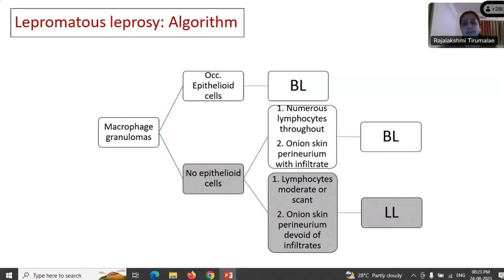And it is not necessary that patients will always come with the typical history of lepromatous leprosy. In fact, we have seen patients coming with type 2 reaction de novo, without a previous history or anything suggestive of leprosy. So I think our index of suspicion should be very high when you see a foamy infiltrate, especially if you're seeing foamy histiocytes in panniculitis and things like that. So we should not miss leprosy.